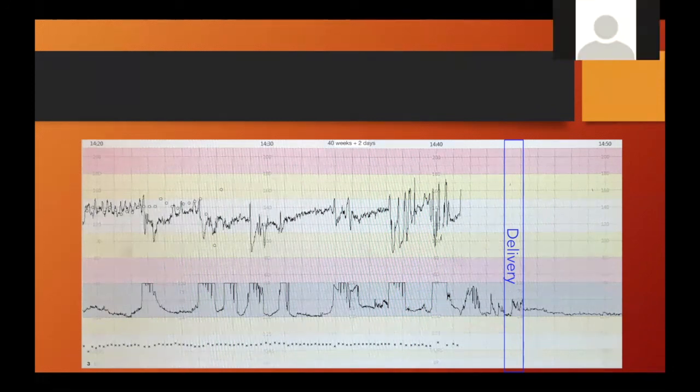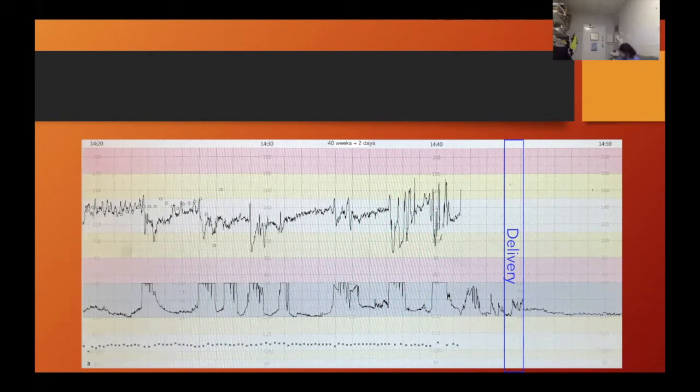7, 8, 9. Why are you saying that? Sorry, it's echoing there. Again? This is going to be a good outcome for the baby. Okay, how have you estimated there's a good outcome for baby? How did you figure out what the outcome is going to be?